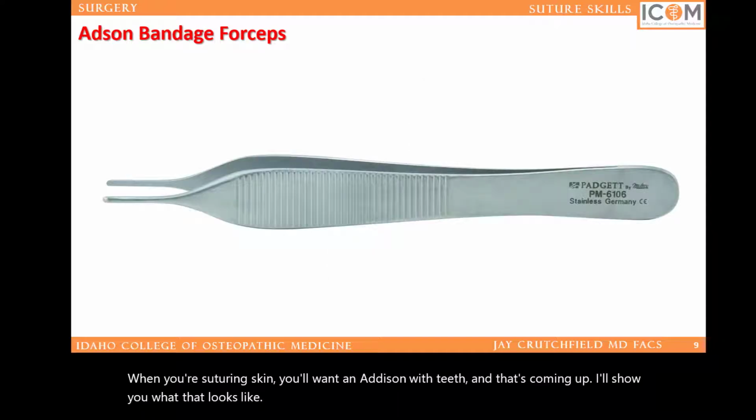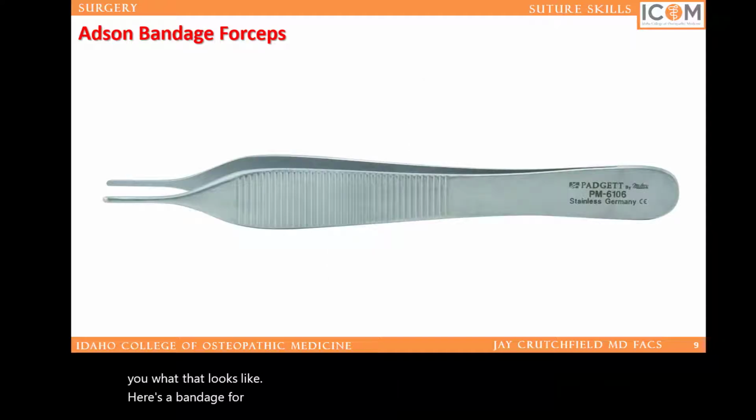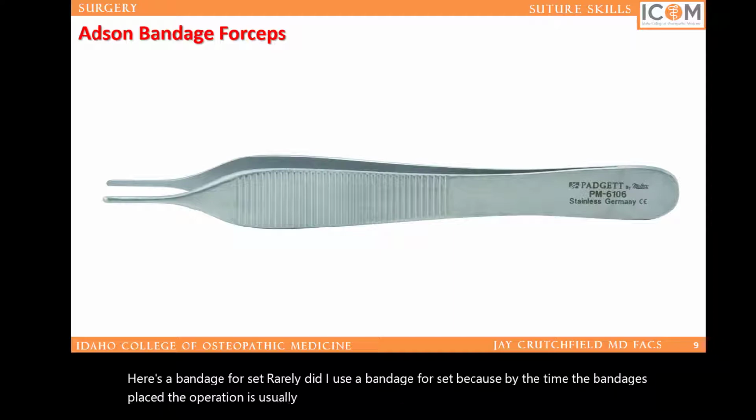Here's a bandage forceps. Rarely did I use a bandage forceps because by the time the bandage is placed, the operation is usually over and pure sterility isn't usually needed.